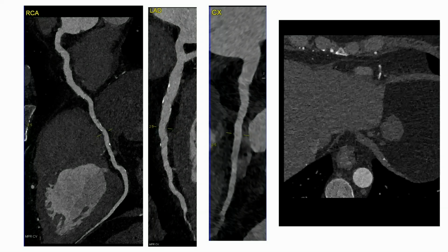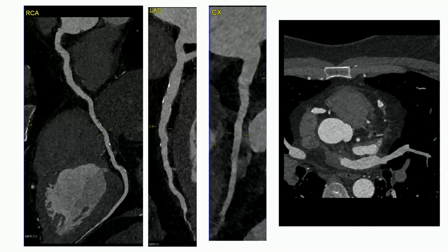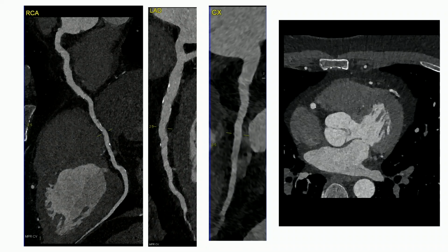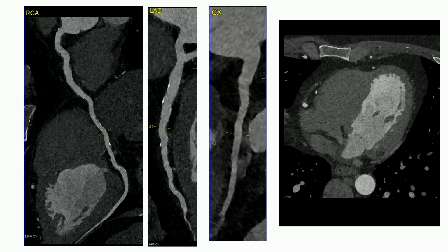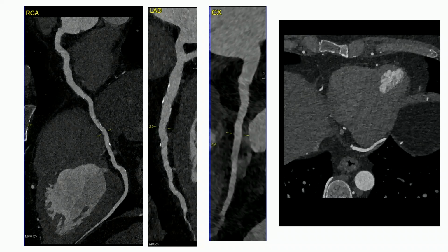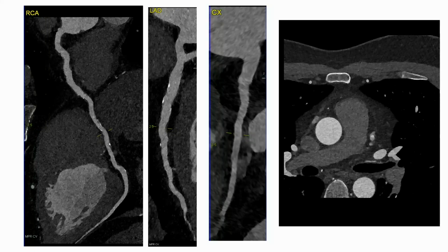You can see the axial images on the right as well for those who want to look through those. But certainly, if anyone were to guess the amount of plaque here, I think some people would say minimal. There's maybe a couple of little areas of calcified plaque. It's not super impressive, but of course he's 32, so you'd say, well, for his age, it's impressive to have any plaque.